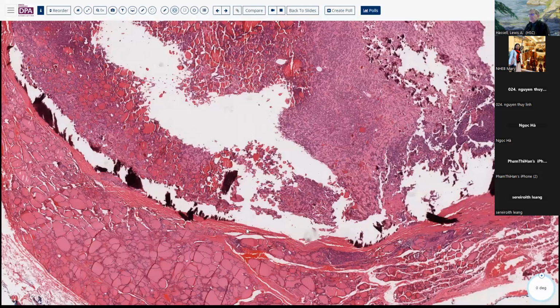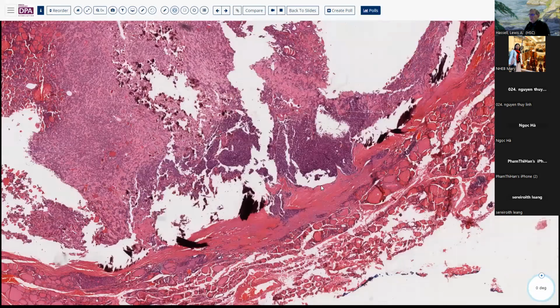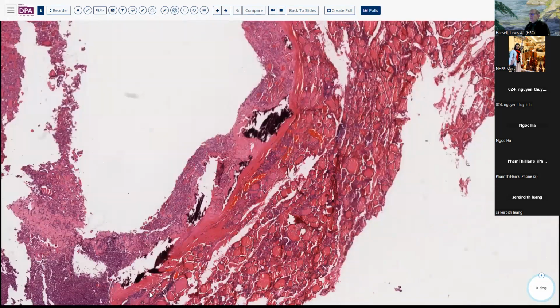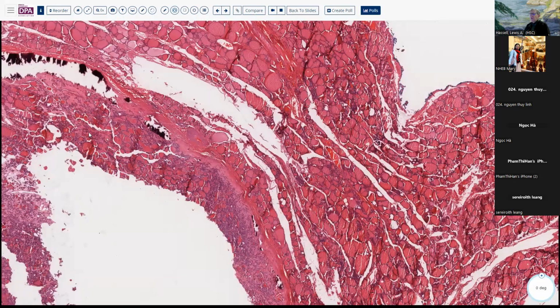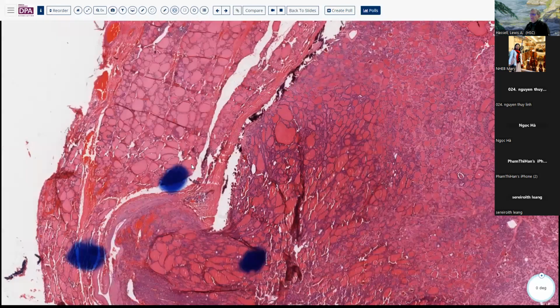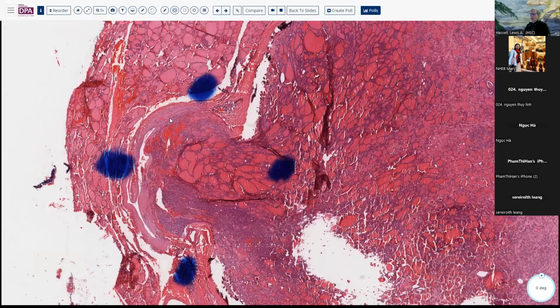Again, you'll notice that this follicular tumor has a fairly dense capsule, and we see other areas where we get suggestion of invasion or indentation of this capsule. These tumors are notable for making new capsules after they've penetrated, so that's something to be aware of. If you get penetration like we have over here and it sticks around for a little while, this is going to provoke additional fibrosis around this area. And so it may look like this is still encapsulated in a single focus.